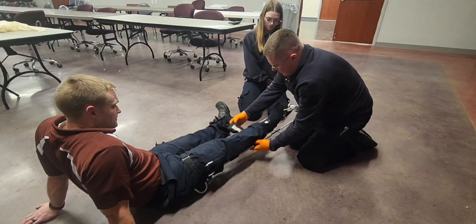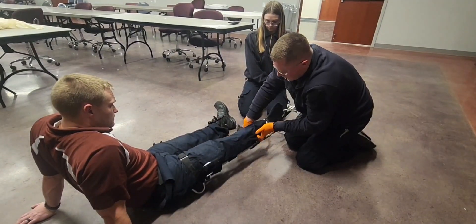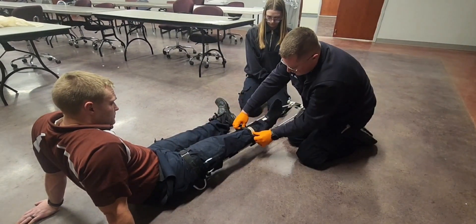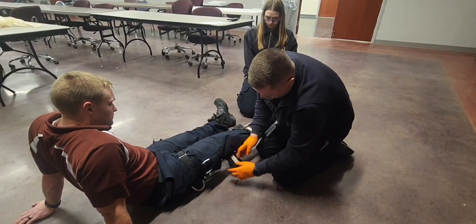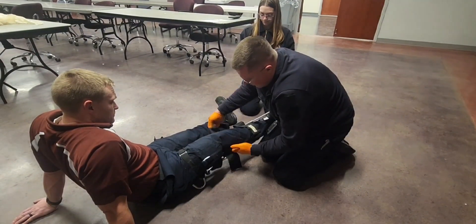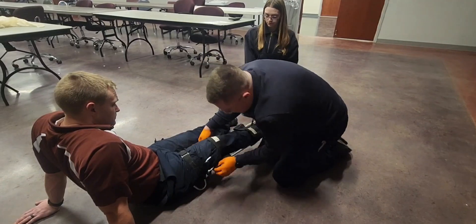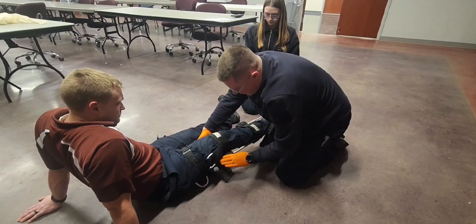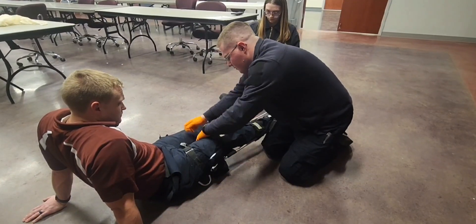Now that this one is applied, we're going to secure these other straps. This one's going to go slightly above the knee. And we have a third one right here — this one's going to go just above the break.